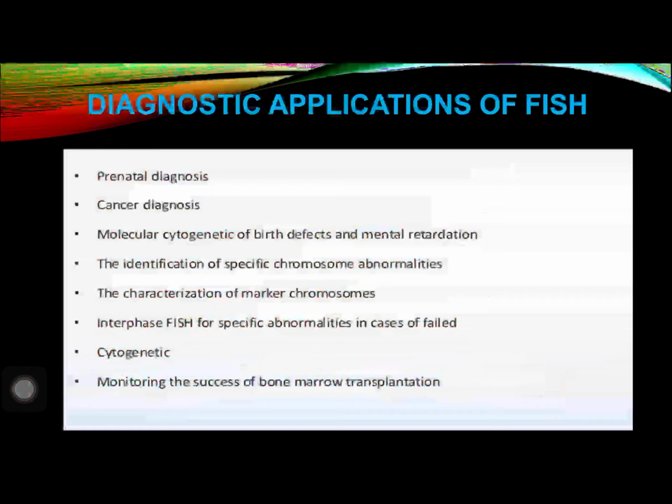Diagnostic applications of FISH: prenatal diagnosis, cancer diagnosis, molecular cytogenetics of birth defects and mental retardation, the identification of specific chromosome abnormalities, the characterization of marker chromosomes, interphase FISH for specific abnormalities in cases of failed cytogenetics, and monitoring the success of bone marrow transplantation. Thank you for listening.